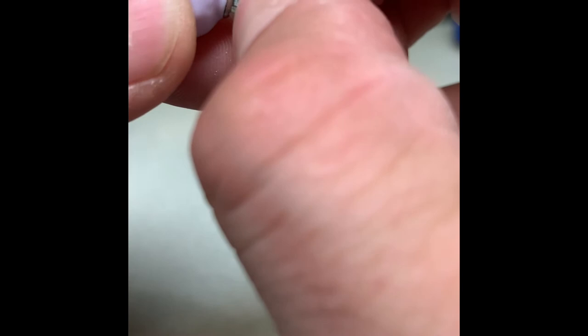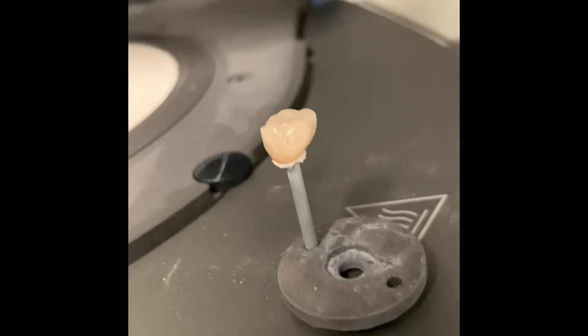Stain and glaze just like I always do. Now we're just glazing. So there it is out of the oven.